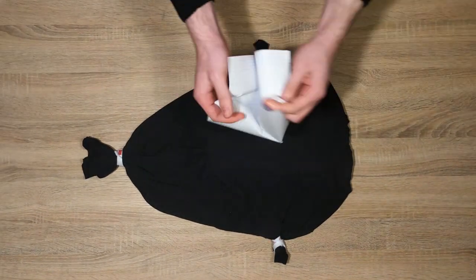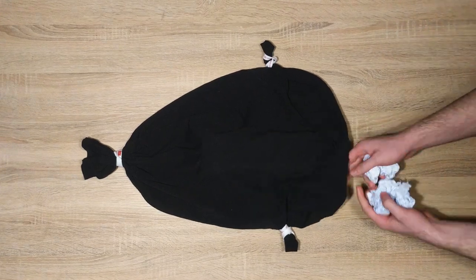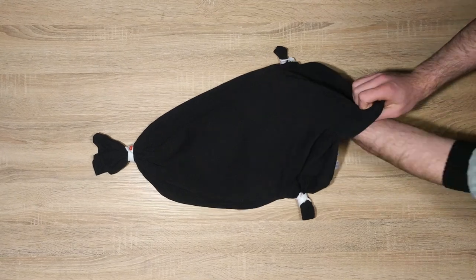Take whatever material you are using for filler and insert it into the shirt around the bottle. Ensure that you keep the bottle correctly aligned down the front center of the shirt.